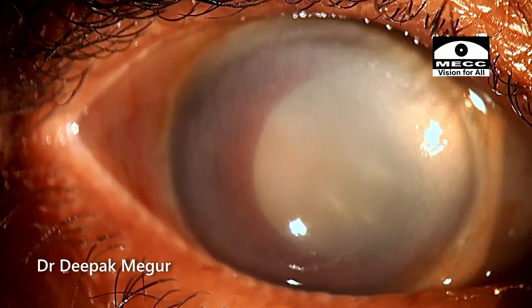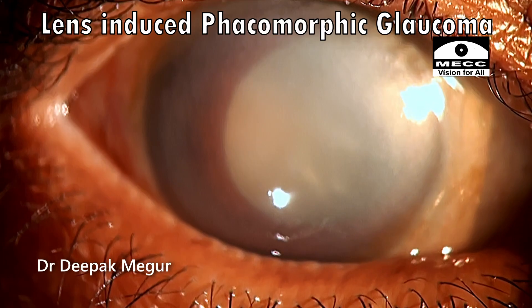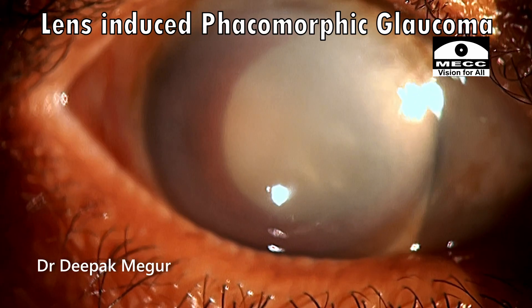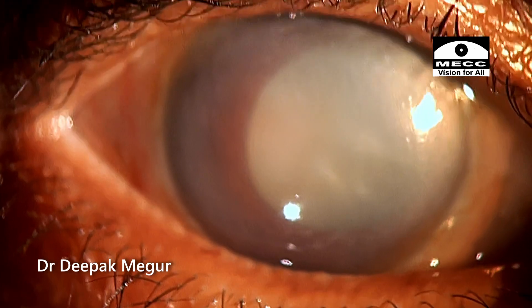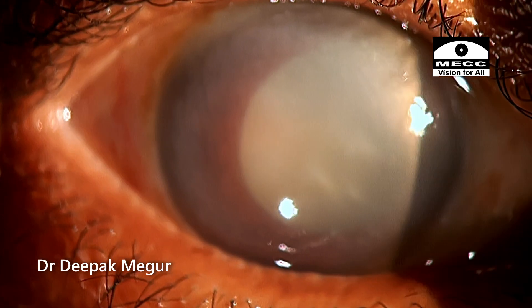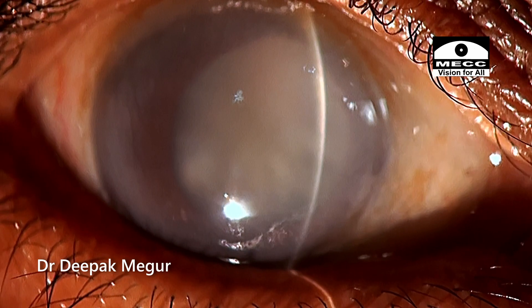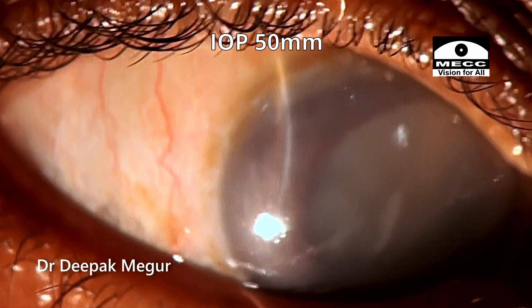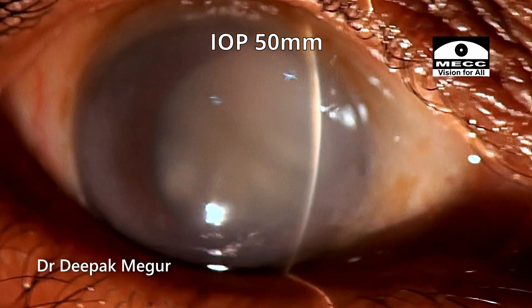Hi, I'm Dr. Deepak Meghur and today is yet another very interesting case of a lens-induced phacomorphic glaucoma in an elderly lady. She presented a few days back and we started on treatment with mannitol and all anti-glaucoma medications and anti-inflammatory drugs like topical steroids. In spite of all the medications, three days later her pressure continued to be 50 mmHg and this was the day wherein the surgery was planned.